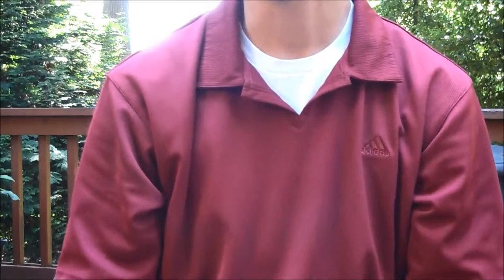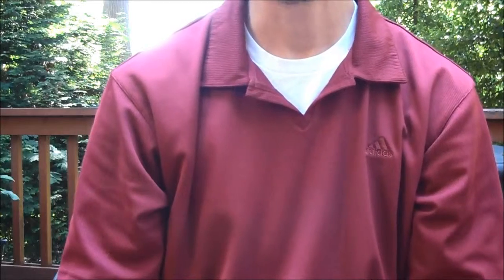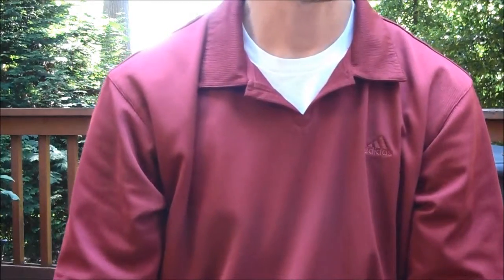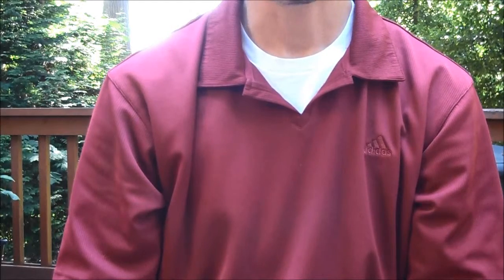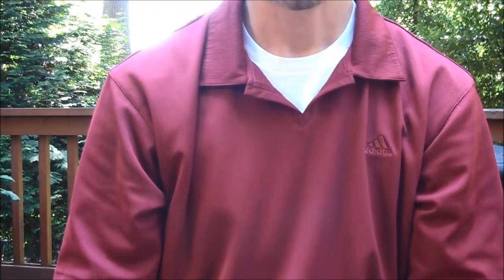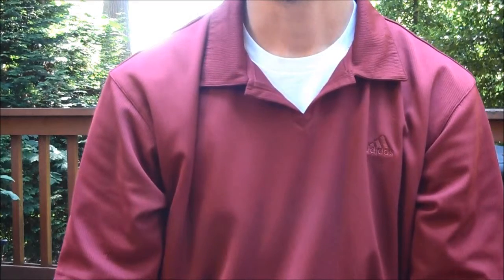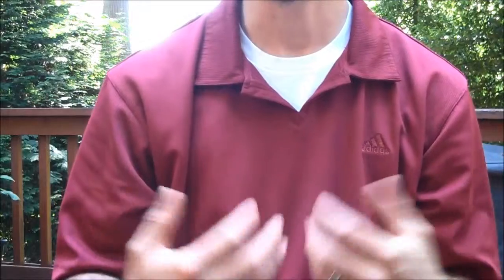It does fall short on some of the spontaneous exclamations that kids like to say, like gross and oh, that's funny. But it does work as a pretty reliable communication technique when Tobii's not available for whatever reason, and it is a no-tech solution that I always have with me and is always available.